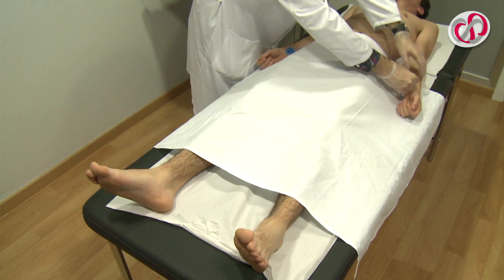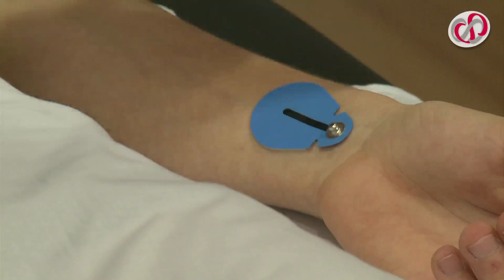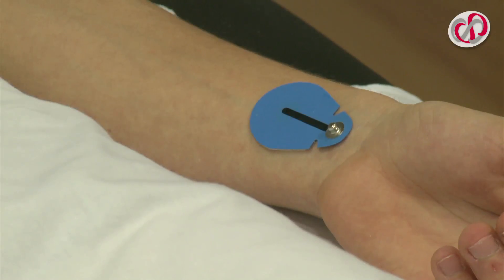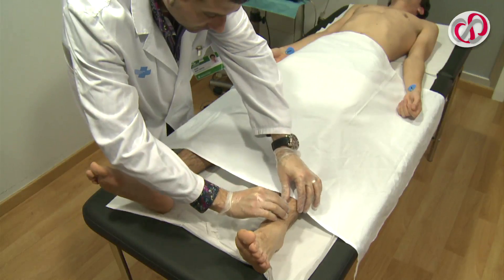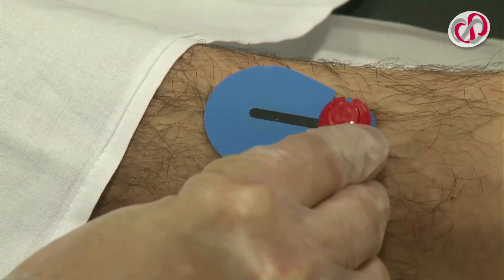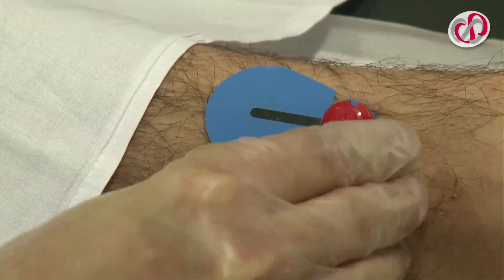Then electrodes are placed on the patient in order to obtain a continuous electrocardiographic recording.